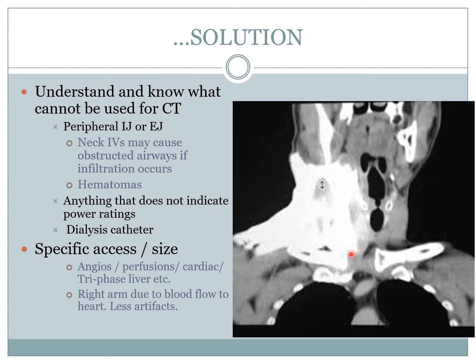The left brachiocephalic vein drains into the superior vena cava and then crosses over to the aortic arch. So when this comes through, it's going to be very fast, and it'll leave artifacts because it's crossing around, and then finally when we need to hit our anatomy of interest or our arteries of interest, maybe the aortic arch or the pulmonary arteries, that'll cause some type of artifacts.